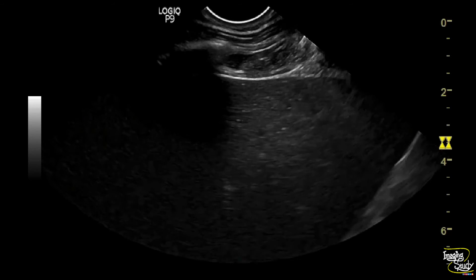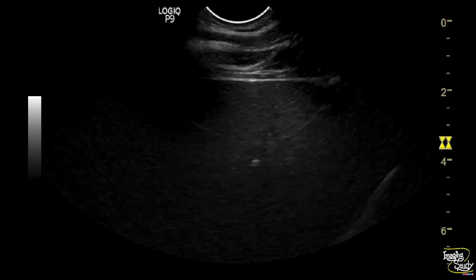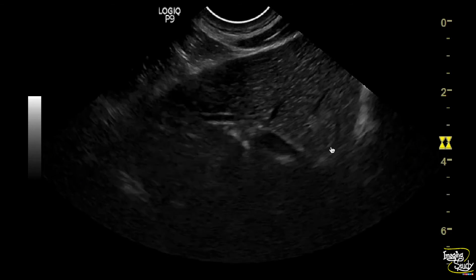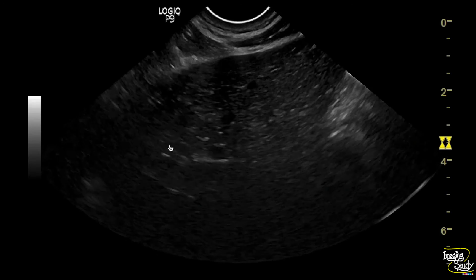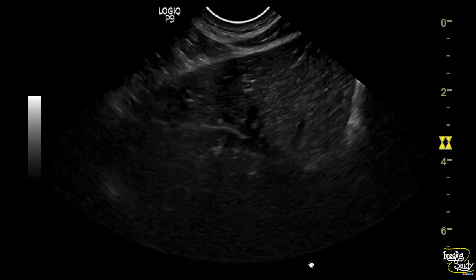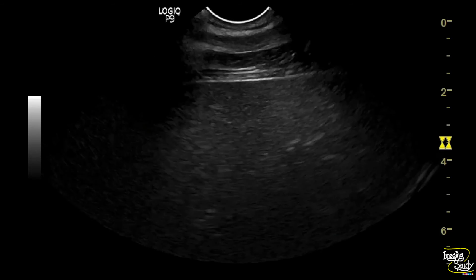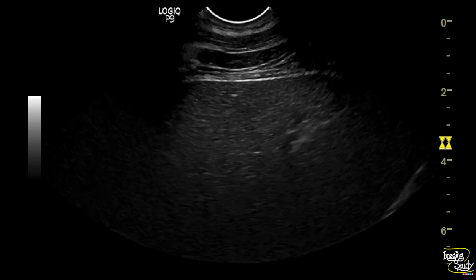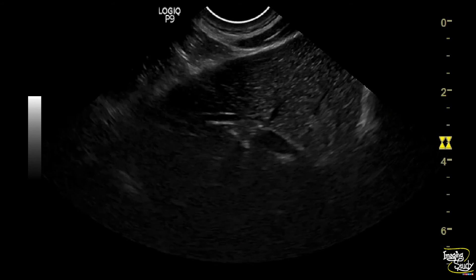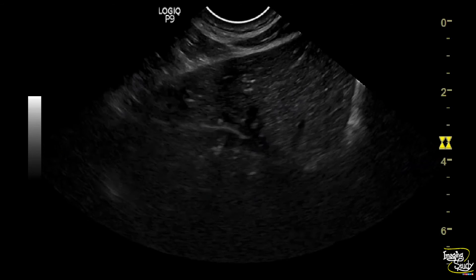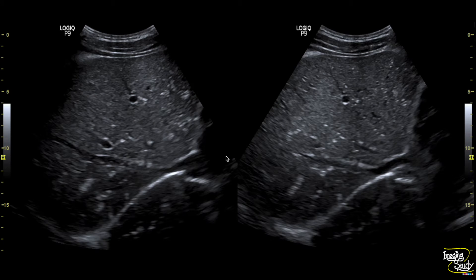To get a better view, we used the transvaginal transducer — and no, it is not a TVS. The transvaginal transducer is not only to be used for transvaginal sonography; it is just a transducer, a machine, so you can use it wherever needed. Here you can see echogenic foci with portal venous flow containing echogenic air droplets. The hyperechoic foci are distributed peripherally, indicating air droplets entrapped within the distal branches of the portal vein.